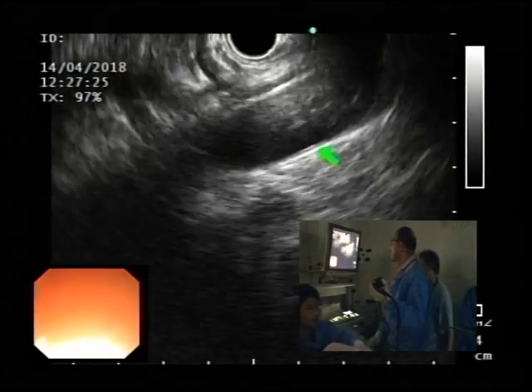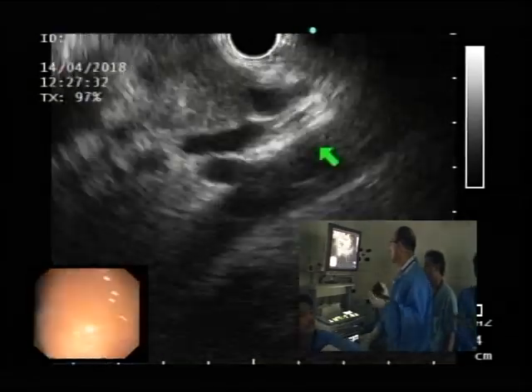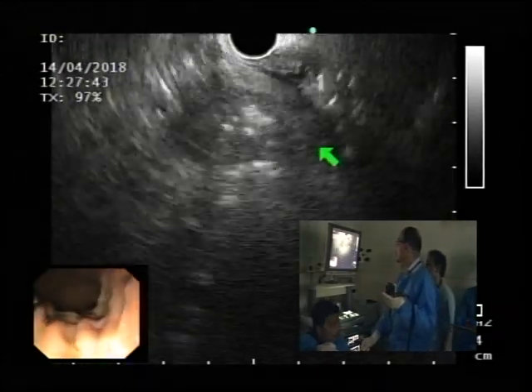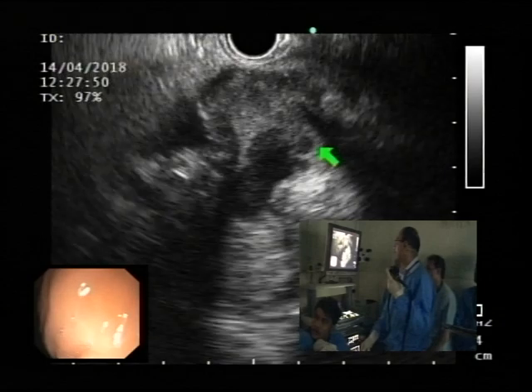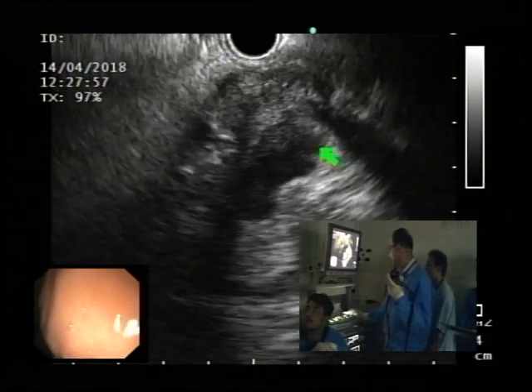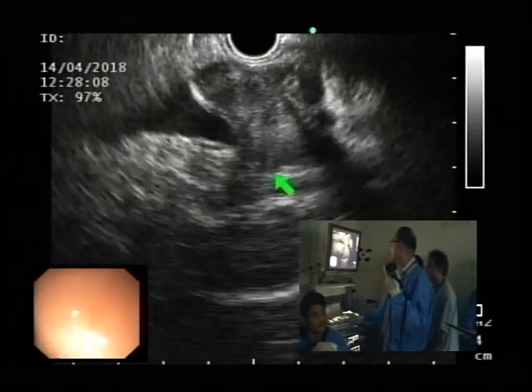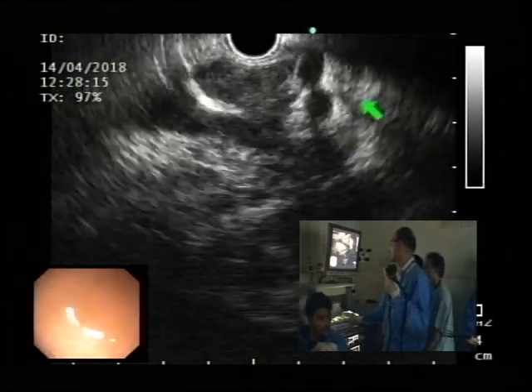So clockwise guys, aorta, celiac, push in a bit, go more clockwise, and usually they'll take you directly to the pancreas, right there. And then as we follow it counter, we go towards the neck body, and there's the portal confluence, there's the pancreatic duct. The pancreatic duct is going down towards the head neck area this way, and this is your splenoportal confluence. SMV is going down this way, portal will come down this way, and splenic vein will be this way.